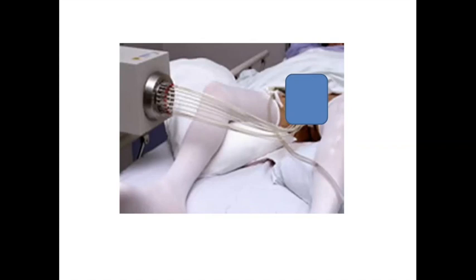And then when that plan is ready, the patient comes into the protected room, and these plastic cables here are connected to the tubes that were hanging out of the perineum, the area down just behind the genitalia. And the tubes, these cables here, are connected to a lead-lined box, and inside there is the radioactive source. And the radioactive source is on the end of a long cable, and that long cable then forces its way down through each of the cables into the plastic tube in the prostate, one after the other.